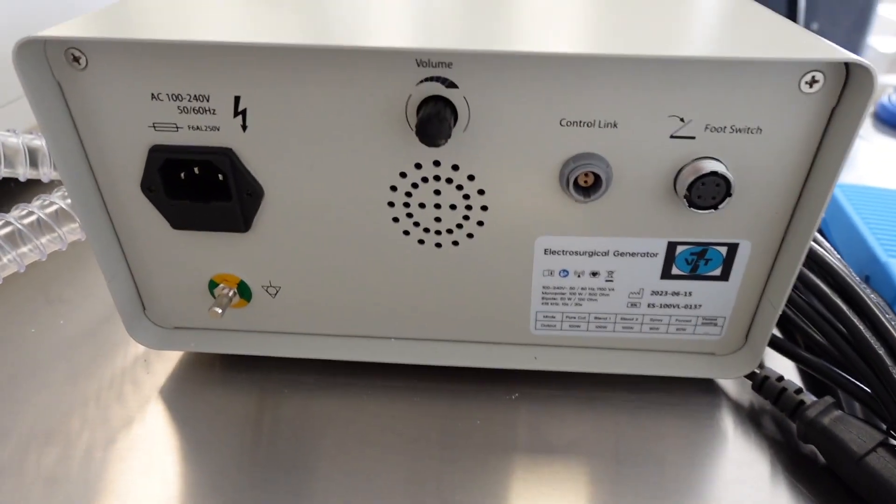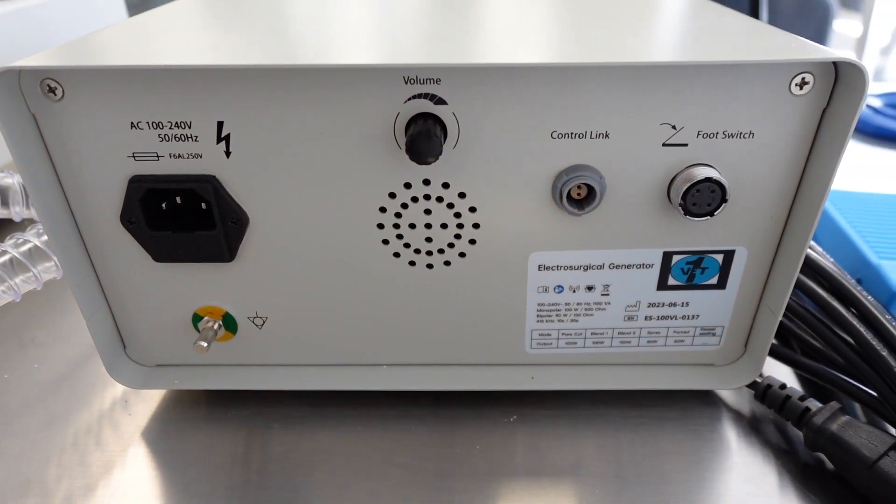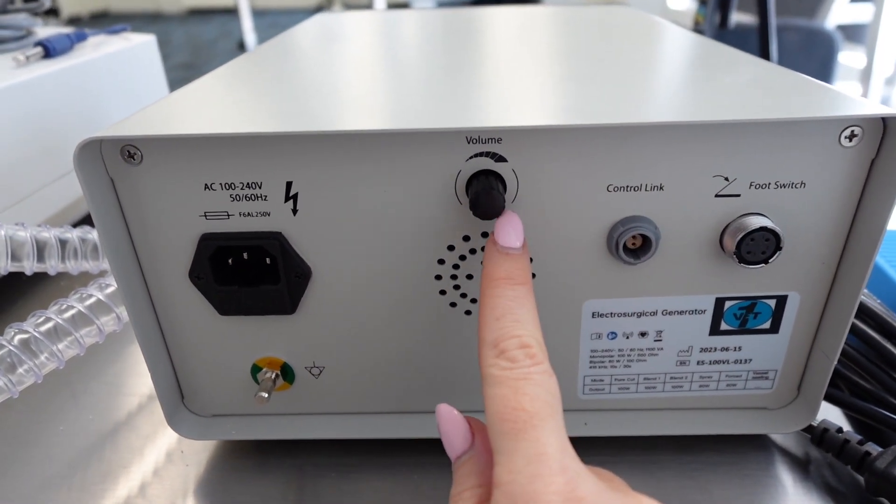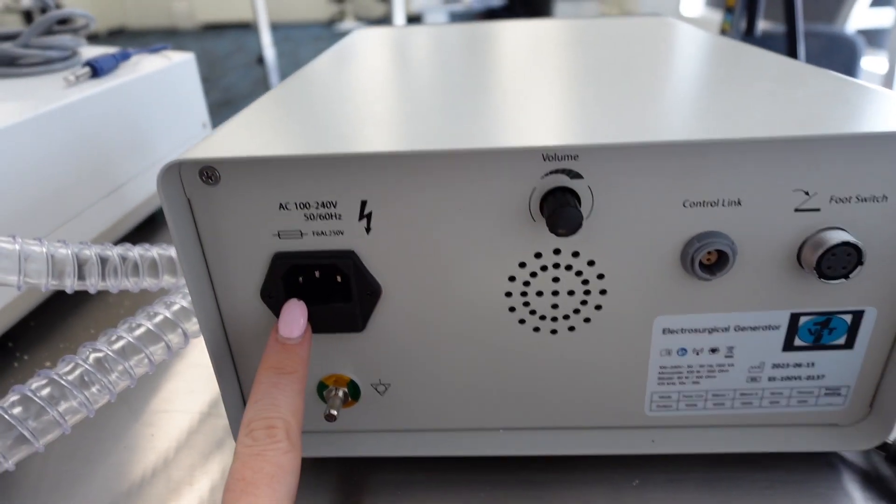At the back of the unit there are a couple of attachment areas: you've got your plug for your foot switch, a connect link, a volume adjustment knob, and your power inlet.